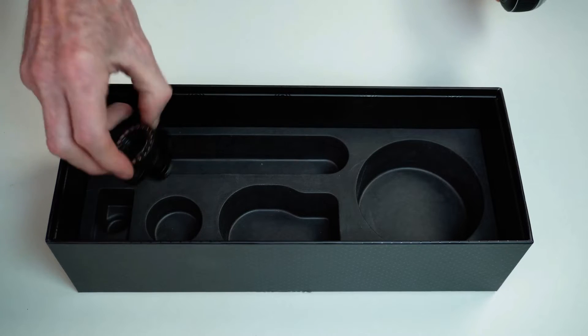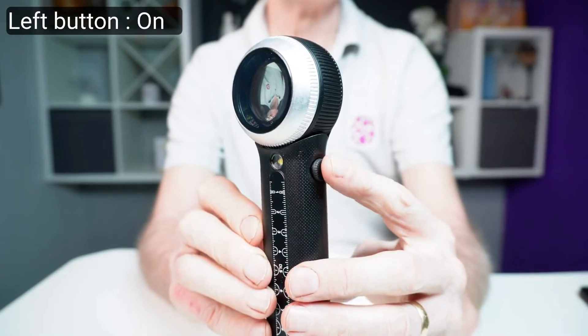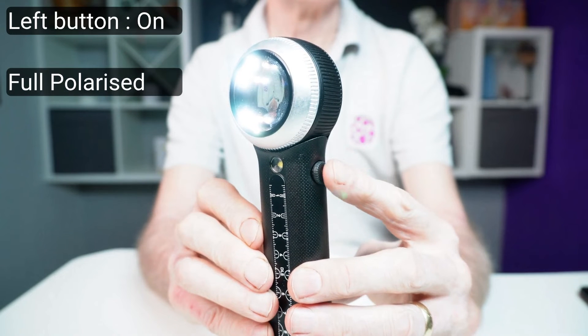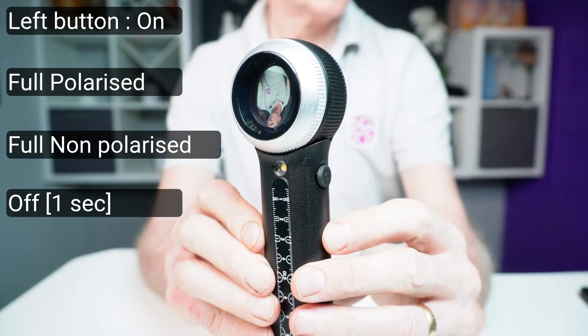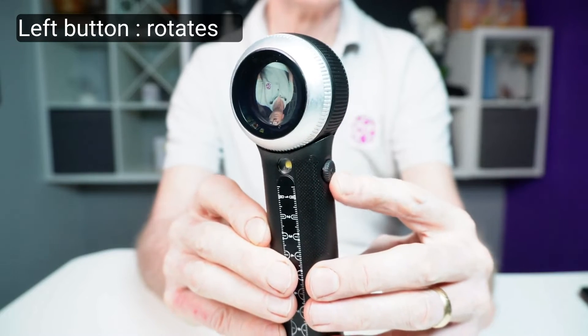There's a magnetic connect clamp adapter for smartphones or tablets. How to operate it? There are four buttons. On the left-hand side of the handle, there's only one button. Push it briefly to switch the dermascope on — it starts in full cross-polarised light mode. Another short press switches it to non-polarised light. If pressed longer than one second, it switches the dermascope off. If you don't understand the basics of how dermoscopy works and polarised versus non-polarised light, watch this video here.